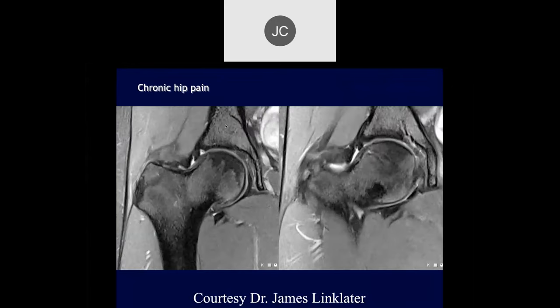Looking at that superior labrum, I'm not sure that's a tear. It looks very smooth. I think that's a sublabral recess, maybe. Chondrolabral junction defect, right? Yeah, it could be a tear. A little bit of a step off down here, maybe a little bit of coxa vara.